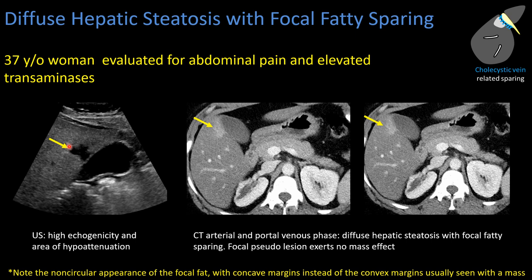This non-circular region of hypoechogenicity in the setting of diffuse steatosis, especially when it abuts the gallbladder, is classic for focal fatty sparing. Additional imaging is often unnecessary unless the patient has risk factors for metastatic disease or primary hepatic neoplasm. This same patient did receive a CT — though MRI is preferred to confirm focal fat — and it shows diffuse low attenuation of the liver with a geographic, non-circular area of hyperattenuation corresponding to focal fatty sparing.